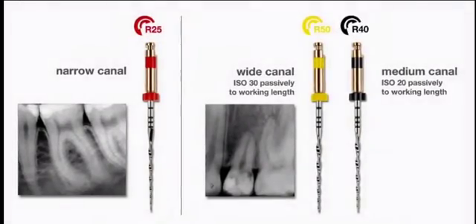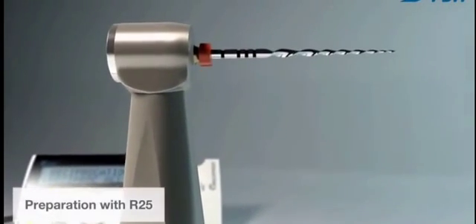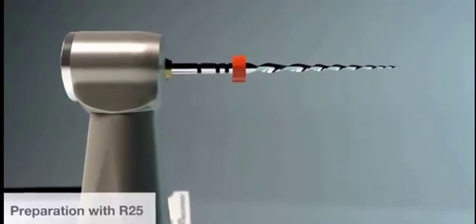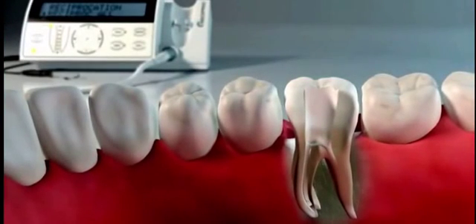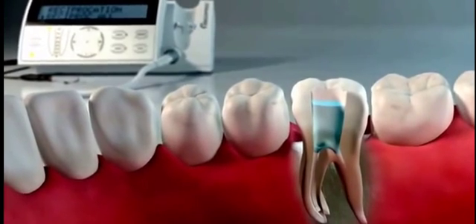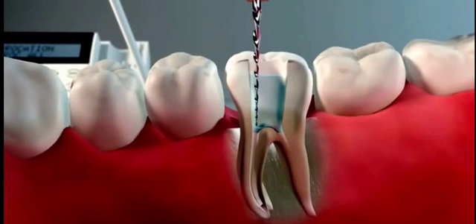At the root canal entrance, estimate the root canal length with the help of a radiograph and set the silicone stopper to two-thirds of the estimated length. Place irrigant in the access cavity and introduce the instrument into the canal.